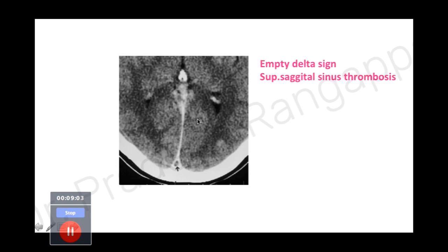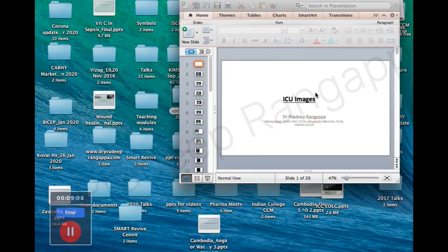This is the empty delta sign, consistent with superior sagittal sinus thrombosis - a finding commonly asked about in exams. I will be uploading more images subsequently for our trainees to review. I have archived at least hundreds of images and will take you through different sessions. Thank you.